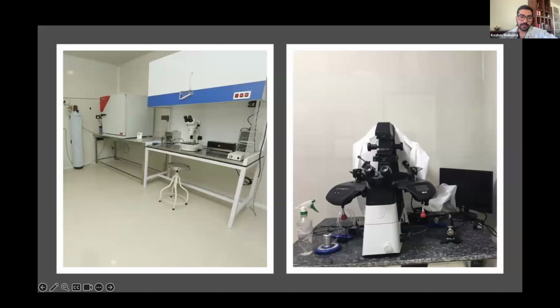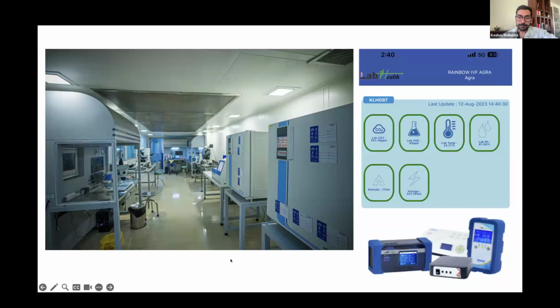Things like a cylinder within the laboratory are something we would want to avoid for ergonomic purposes. Having better stools and countertops matters, especially if there's high vibration within the building itself. You'd want to invest in better countertops, especially for ICSI.